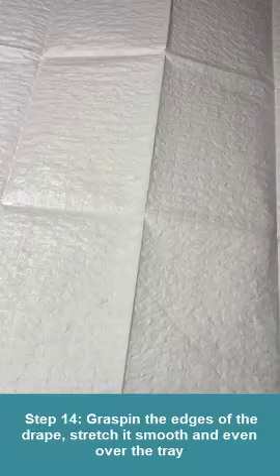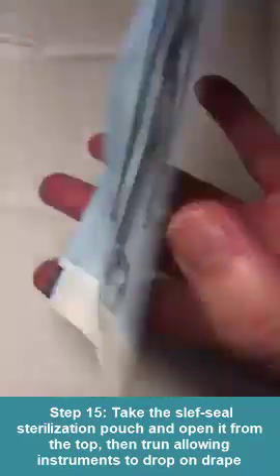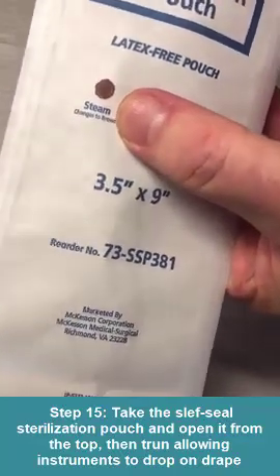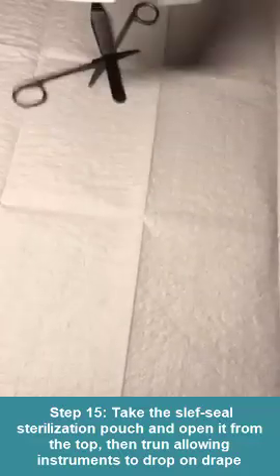I'm going to take my instruments and other equipment that I have. I'm going to drop it onto the drape without contaminating the drape. So the first thing I have is my sterile pack, the suture removal equipment. The steam indicator has turned brown in color, and these are the ones that I initially dated yesterday. So I'm going to open this up from the top without touching the inside or the instrument. I'm just going to let them spill onto the surface.